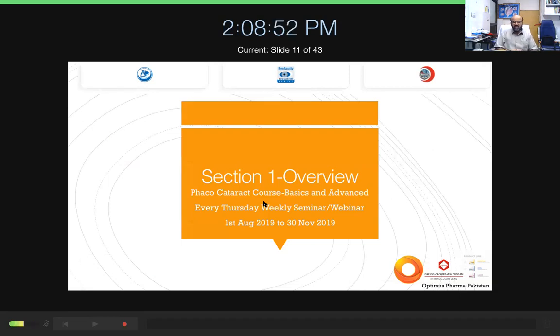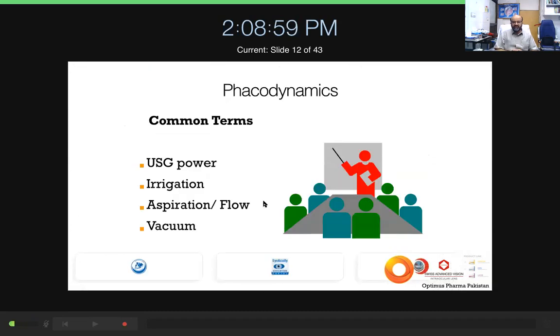So section one is completed, and now we move to section two of today's discussion, that is on Phaco dynamics and the Phaco machine. As you know, these are the terms: Phaco power, irrigation, aspiration flow, and vacuum.